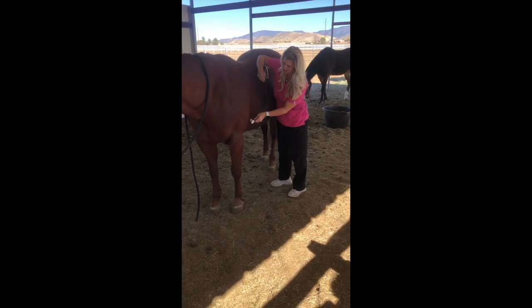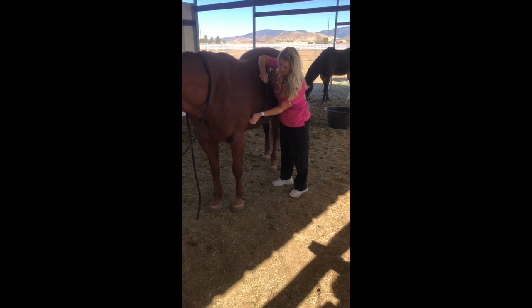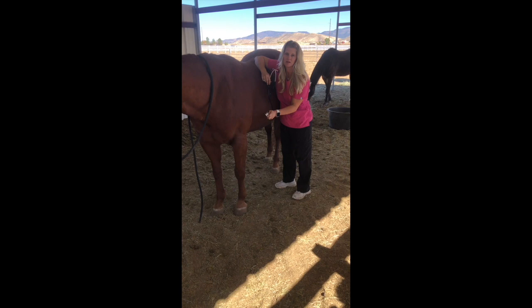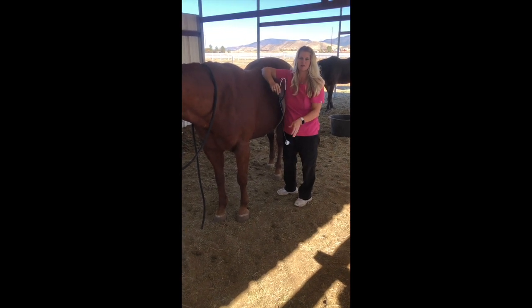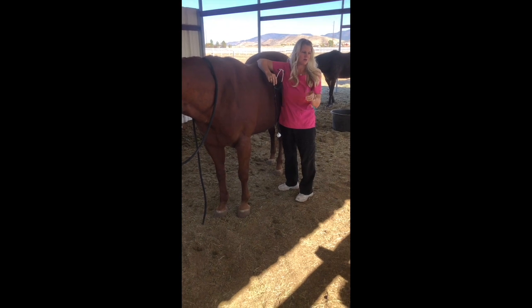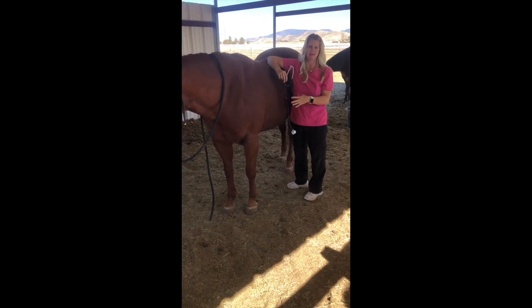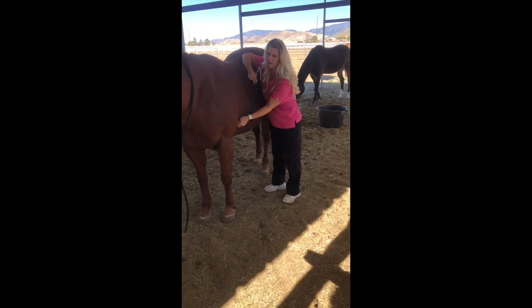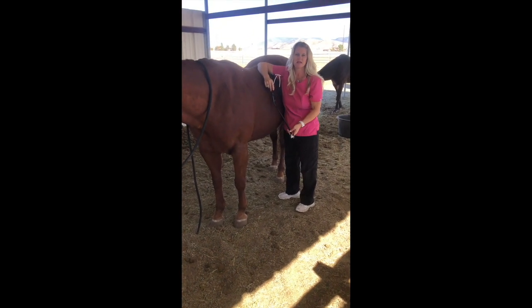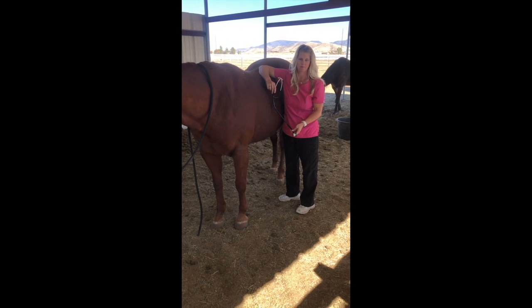Okay, and you take your stethoscope and you're just gonna listen right here, right behind their point of shoulder here, and you're gonna listen for a lub-dub. And it's actually 1 beat per lub-dub. So you're gonna count for 15 seconds. So it's gonna go lub-dub, that's 1. And then you're going to count for 15 seconds and then multiply that by 4.